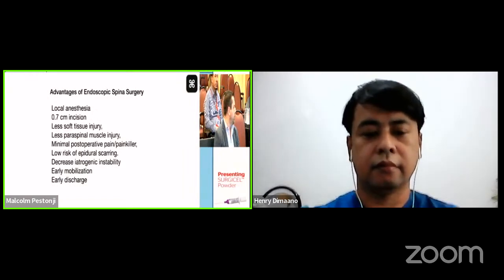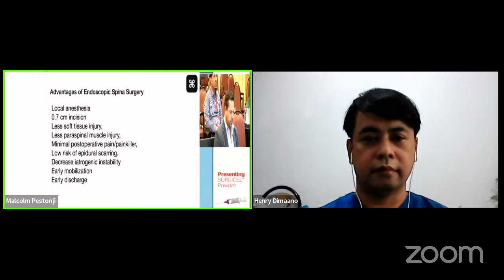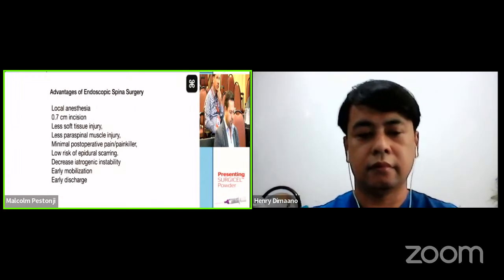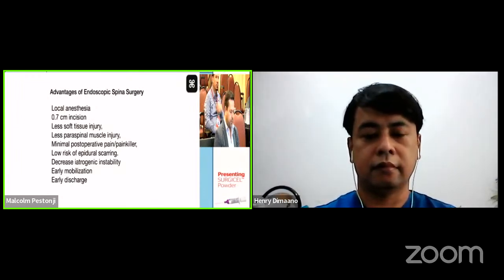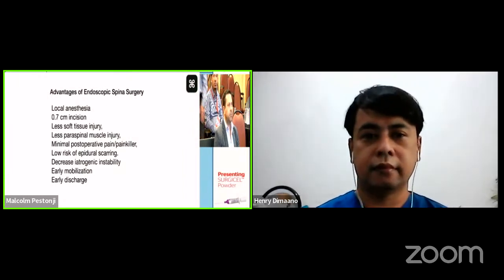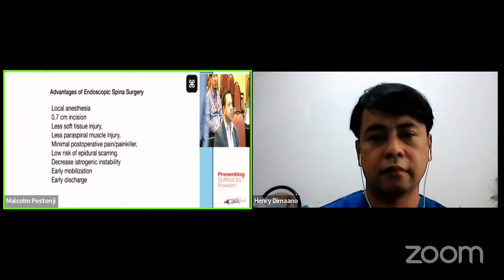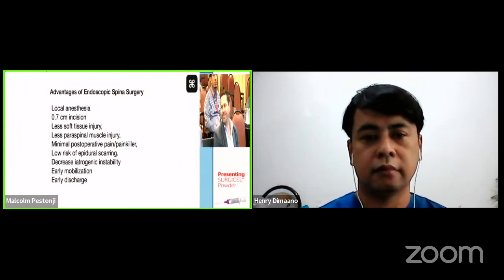Mostly we perform the surgery under local anesthesia. The skin incision is just 7 millimeters. We may see less soft tissue injury, less paraspinal muscle injury, and minimal postoperative pain, low risk of epidural scarring, and decreased iatrogenic instability. We may discharge the patient the same day, and we may mobilize the patients within a few hours. We get a lot of advantages.